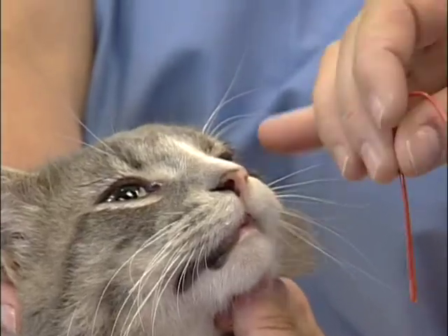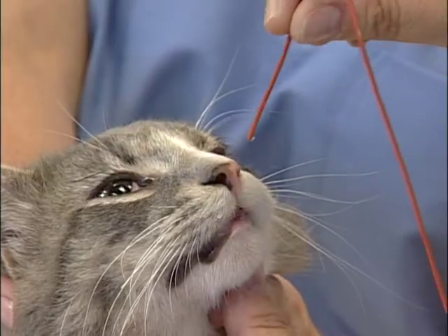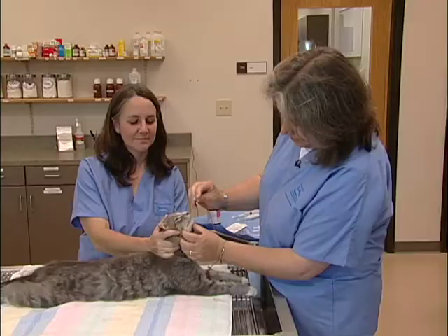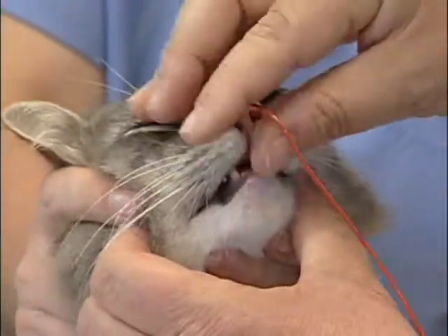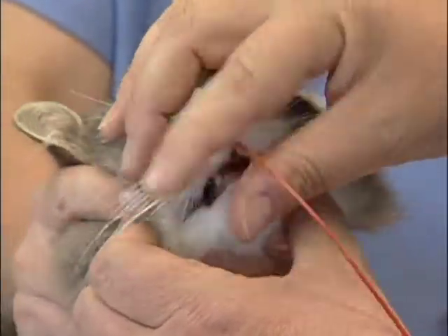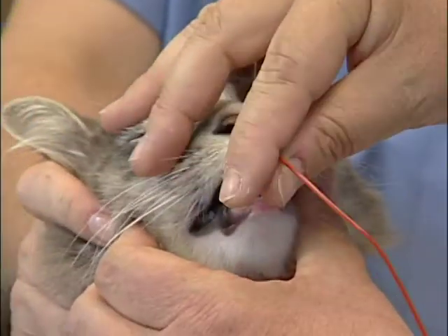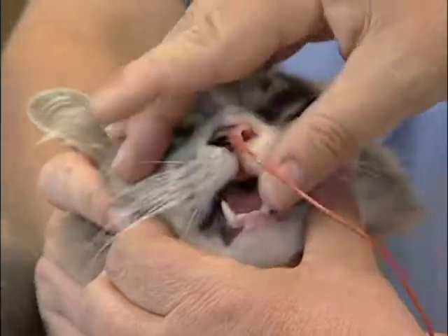I'm going to be aiming towards the base of his opposite ear along the ventral surface, and actually begin to insert it into his nostril. You can see he reacts a little bit, but actually the tube goes quite easily. He's a little bit sneezy — that's not uncommon.